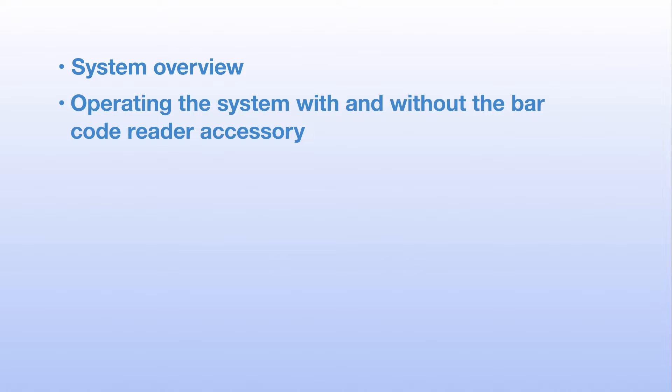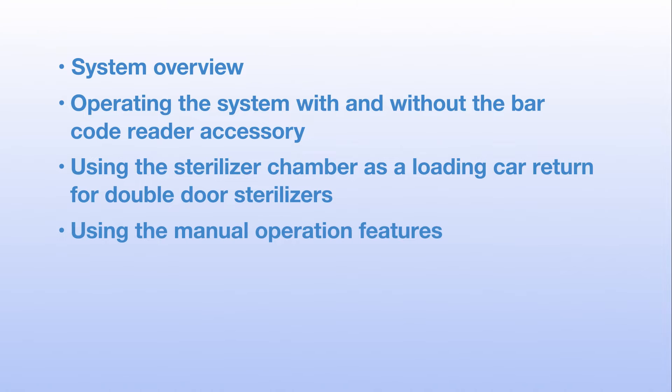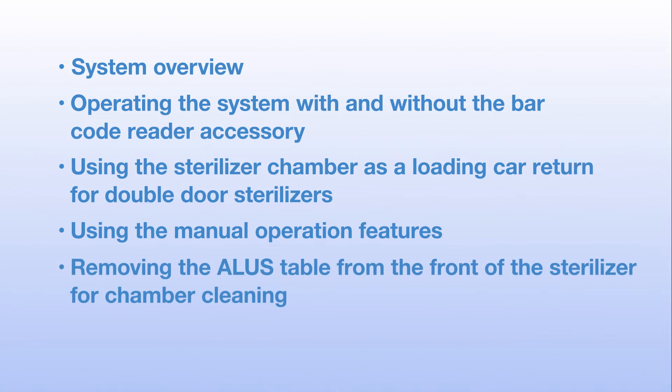Section one: system overview. Section two: operating the system with and without the barcode reader accessory — the barcode reader automatically selects the correct cycle. Section three: using the sterilizer chamber as a loading car return for double door sterilizers. Section four: using the manual operation features. Section five: removing the ALUS table from the front of the sterilizer for chamber cleaning. Section six: routine cleaning and maintenance.